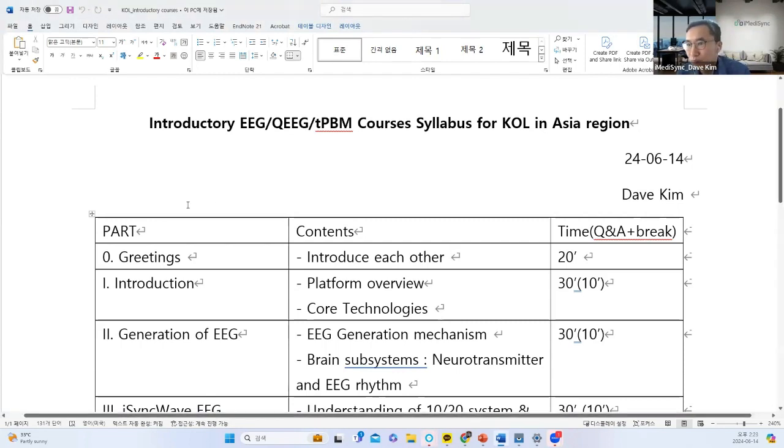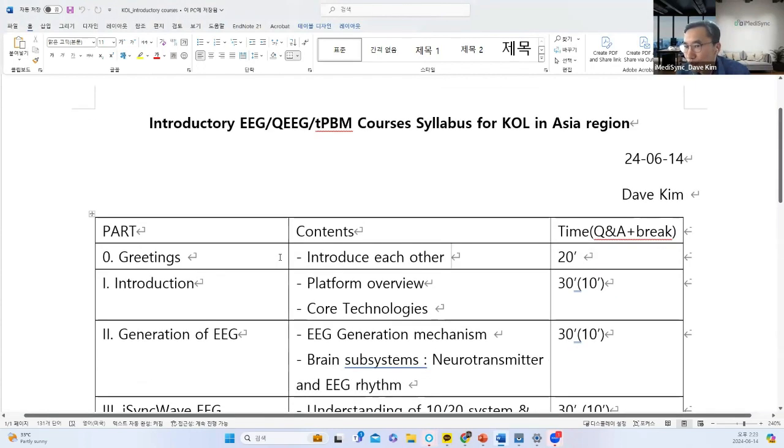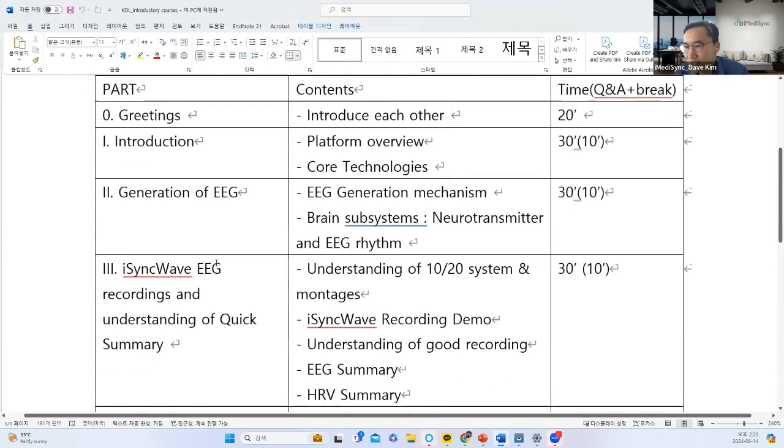I'd like to briefly introduce today's introductory courses. We are at the first item. I'd like to briefly introduce our platform and core technology in 30 minutes, and then I will give you the EEG rhythm generation mechanism, and you can understand alpha, theta, delta, beta rhythm.